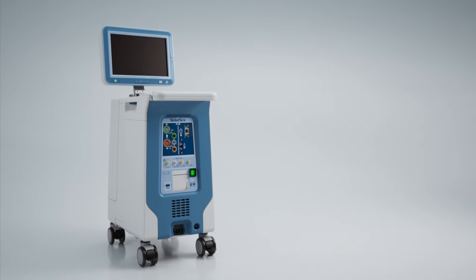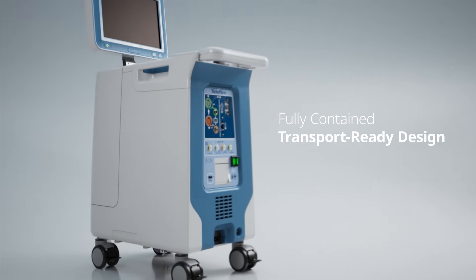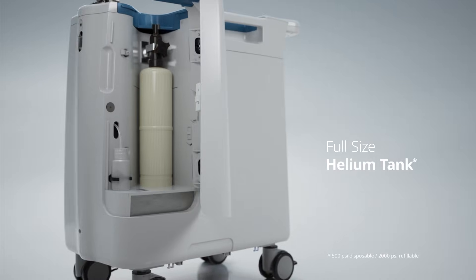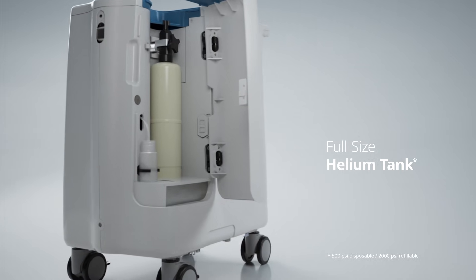The AC3 Range IABP is a fully contained, transport-ready design that delivers consistent therapy on the go. Equipped with a full-size helium tank, this system is designed to deliver uncompromised therapy across all distances.